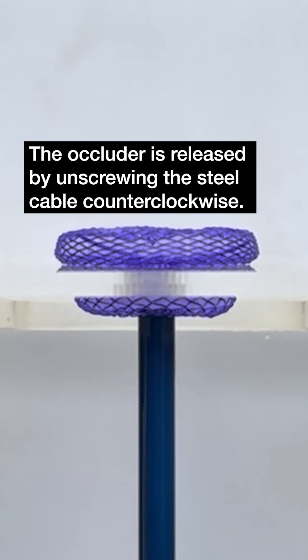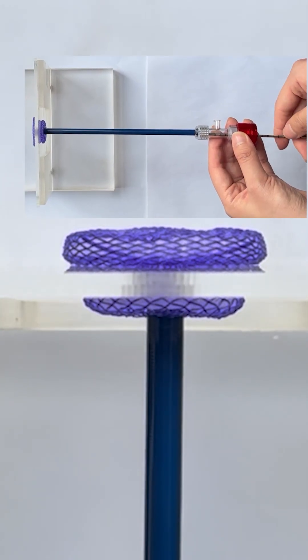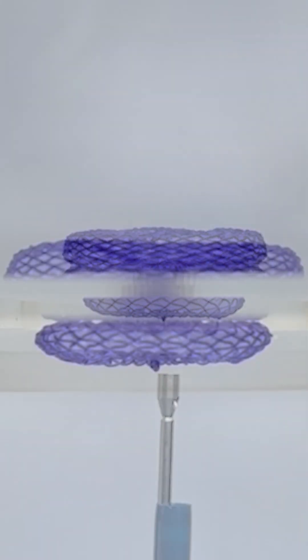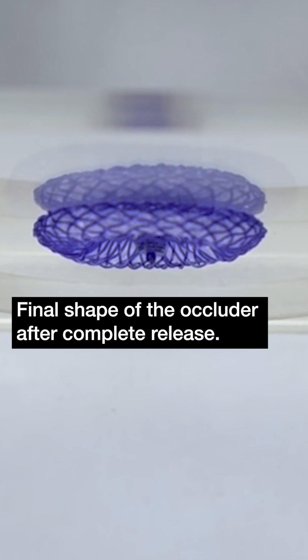The occluder is released by unscrewing the steel cable counterclockwise. This is the final shape of the occluder after complete release.